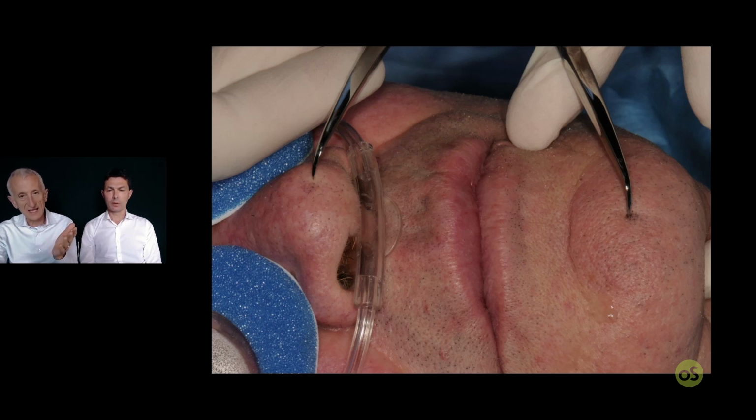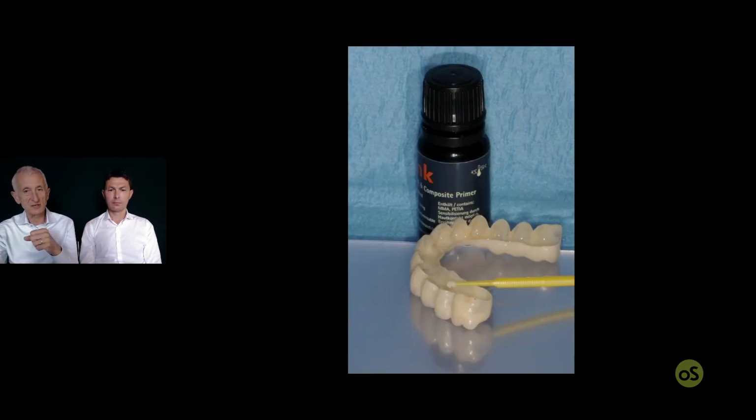And this is the end of the try. So you hand the shell back to Gianluca, okay? And Gianluca will move forward. Now it's time to clean the saliva or blood, sandblast inside the shell, and put on the primer to open the link between the PMMA of the shell and the reline material.